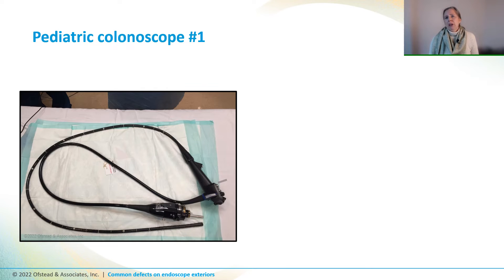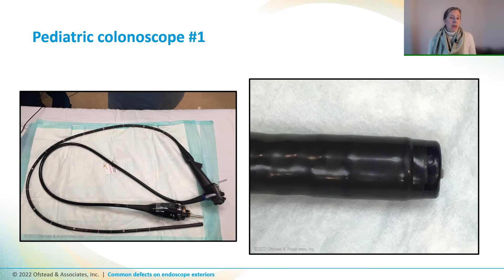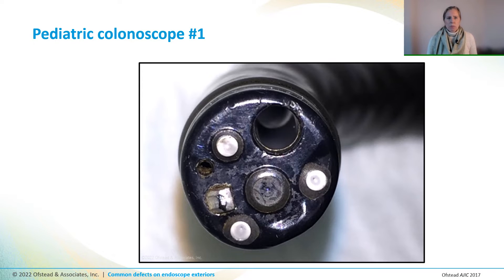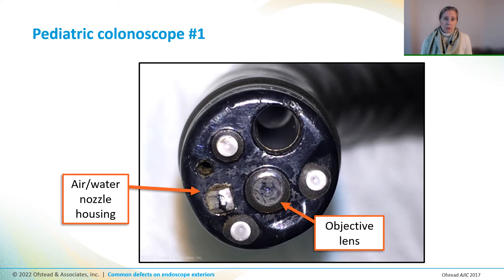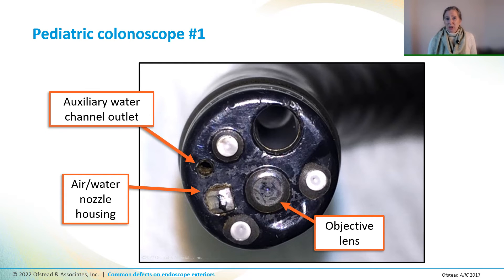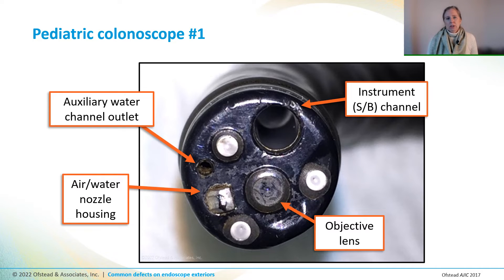Here's a pediatric colonoscope where the distal end looked okay from the side and the adhesive seemed like it was in good shape. But the distal tip had some sort of scale or film on the objective lens, and there was brown stuff around the air-water nozzle housing and inside the outlet of the auxiliary water channel. The scope also had a dent by the outlet of the instrument channel and a little chip on one of the light sources — so this scope is a great candidate for cleaning and repair.